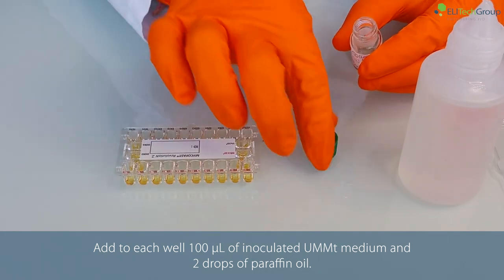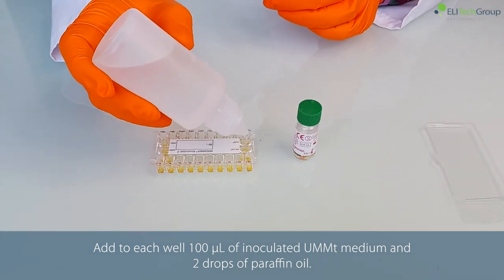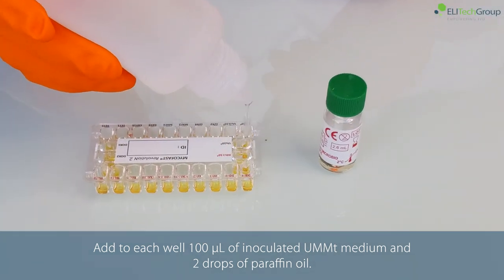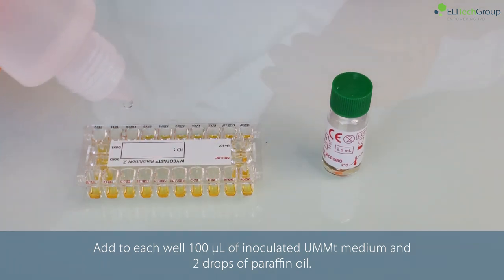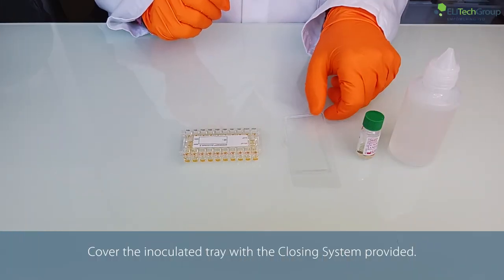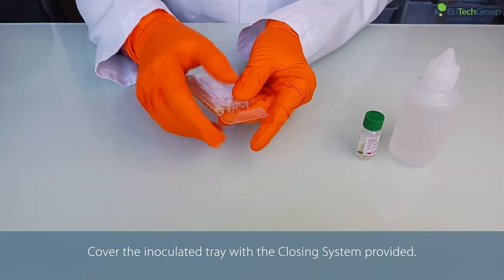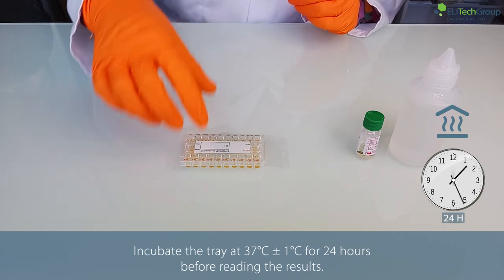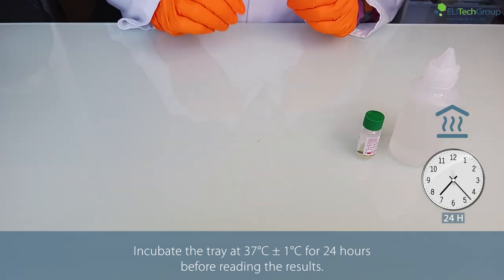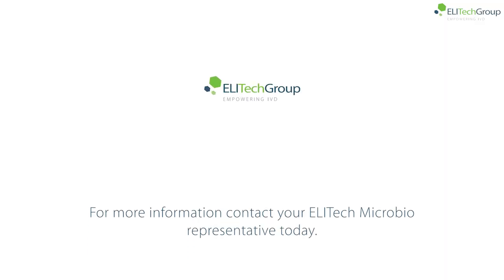Cover the inoculated tray with the closing system provided. Incubate the tray at 37 degrees Celsius for 24 hours before reading the results. For more information, contact your Elitech Microbio representative today.